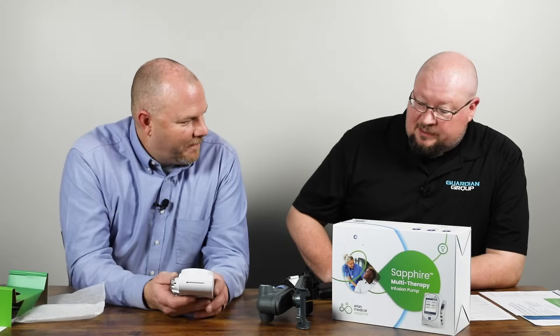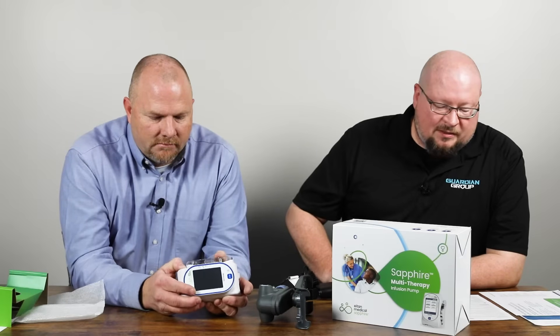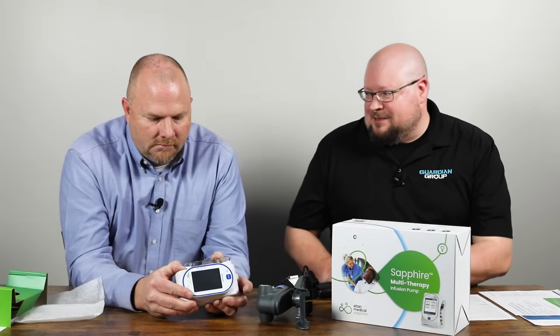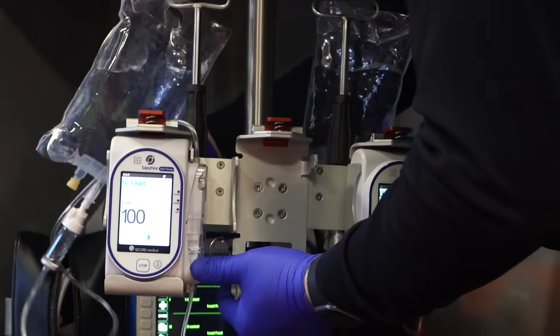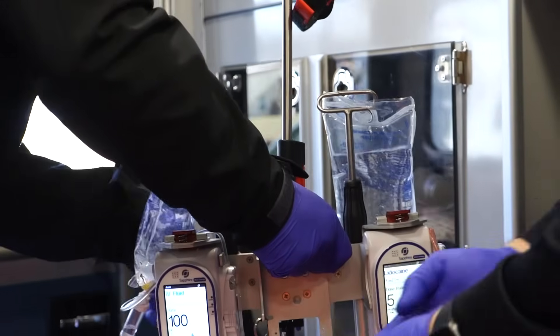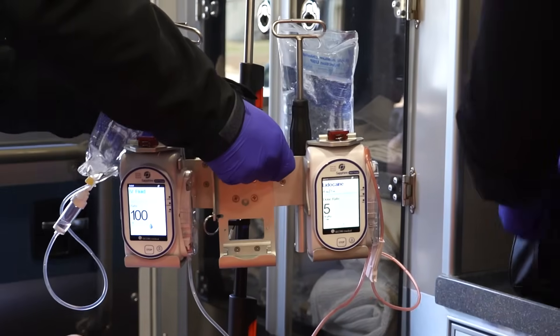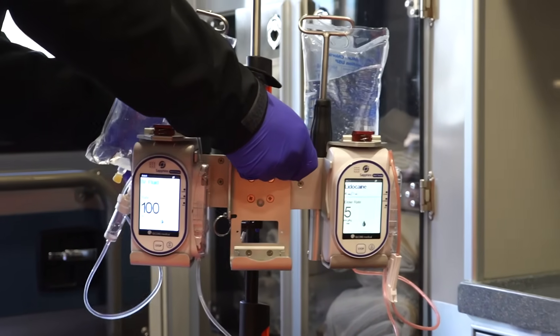It's really important to know that this is not only a single channel pump but also a multi-therapy pump. You can run TPN, PCA — there's a PCA lock box available as an option. You can run piggybacks, epidurals — the sky's really the limit when it comes to this thing. The portability also allows for multiple pumps to be placed together. There are optional mounts where you can put up to three pumps side by side. Ferno Aviation makes a triple mount for the air medical world — they've got single, double, and triple mounted pump options.